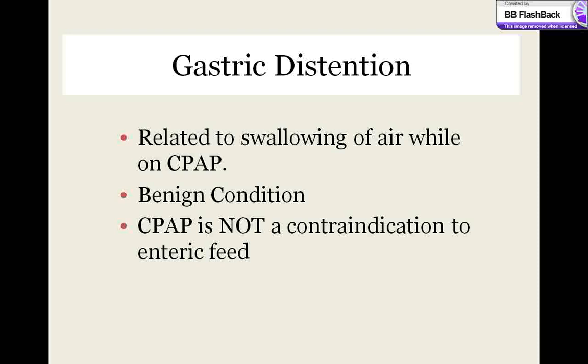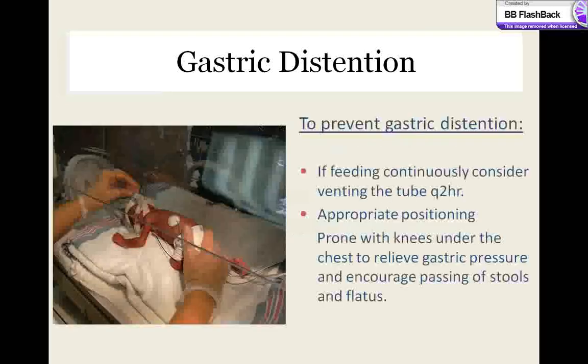Baby can be fed while on CPAP and abdominal distension is not a contraindication for the same. Feeding tube should be left open to vent gastric air. Prone position helps in relieving gastric pressure and encouraging baby to pass stool and flatus.